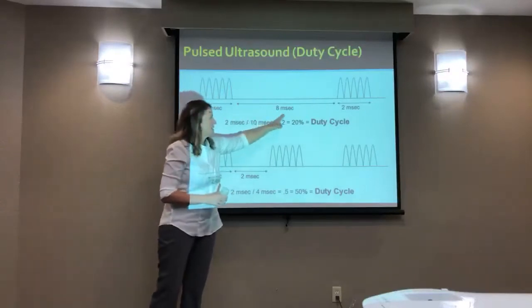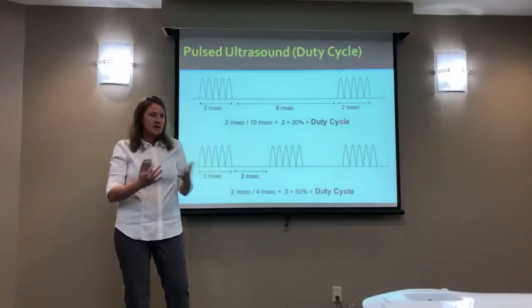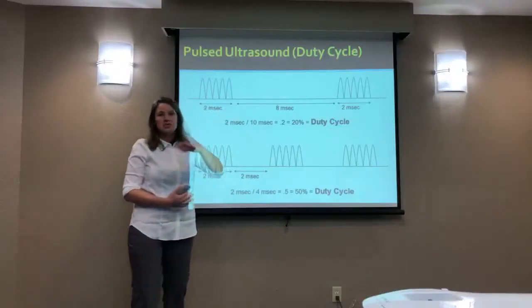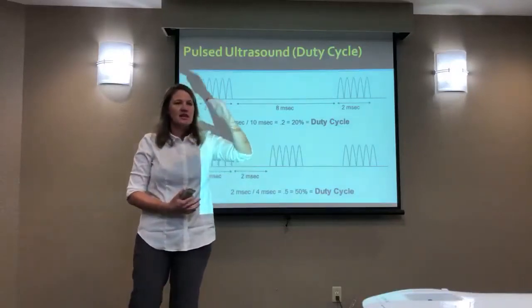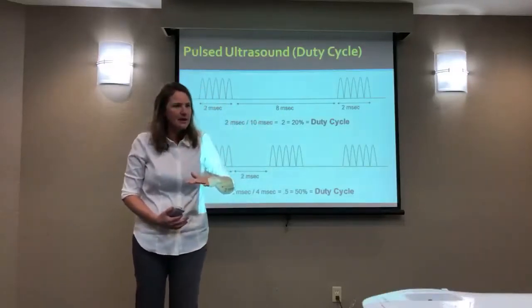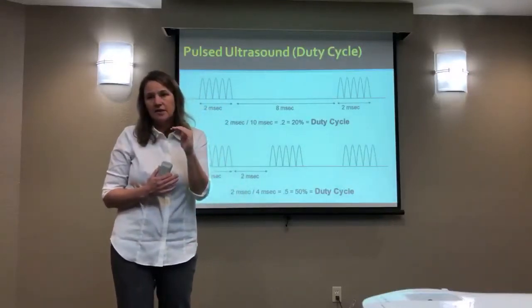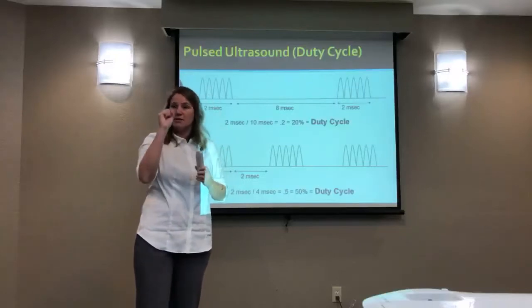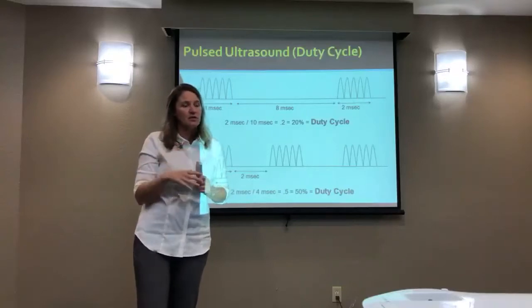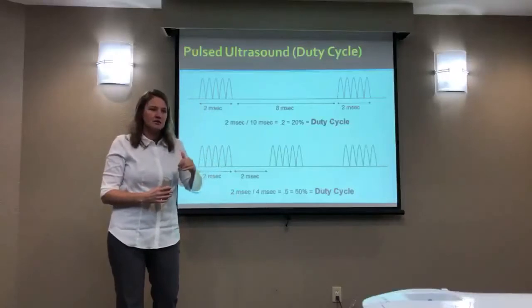And then during the 8 milliseconds, assuming you have blood flowing through that tissue, the blood flow is going to negate any temperature rise that there was. So in the 20% on, slight energy deposition, slight rise in temperature; 8 milliseconds off, blood flowing through brings it back down again. So the difference from just doing a low intensity is that you can have a higher intensity, when you think about it as sort of shaking the cells up, but you can still not have a heat rise. This would be when you want kinetic energy without the temperature rise.